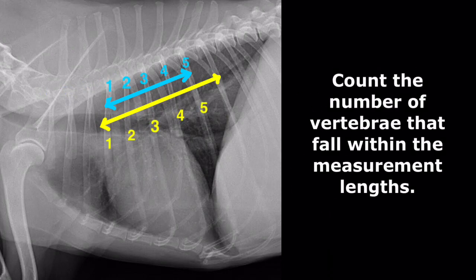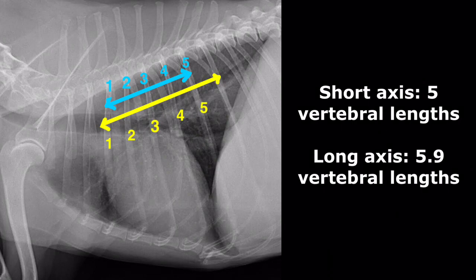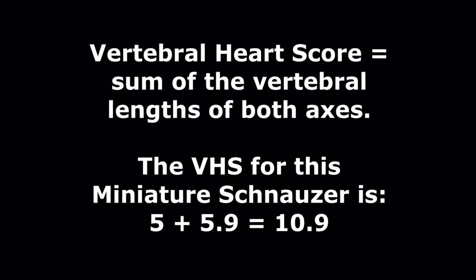Count the number of vertebrae that fall within the measurement lengths for each of the measurements. The short axis has 5 vertebral lengths. The long axis has 5.9 vertebral lengths. The VHS is the sum of the number of vertebral lengths occupied by both the long axis and the short axis. The VHS for this miniature schnauzer is 5 plus 5.9, which is 10.9.